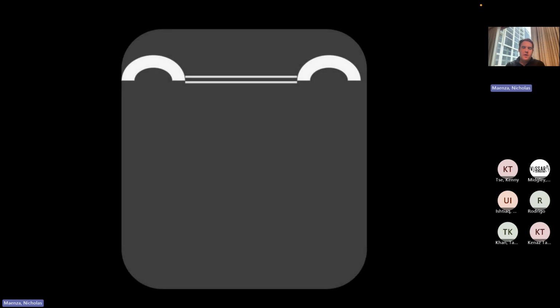So lung sliding. Again, we have this cartoon. So what is lung sliding? You've got this rib with the shadow, and you have that visceral and parietal pleura. So every time that patient takes a big breath, that pleura on the viscera just goes back and forth and slides along that parietal pleura.